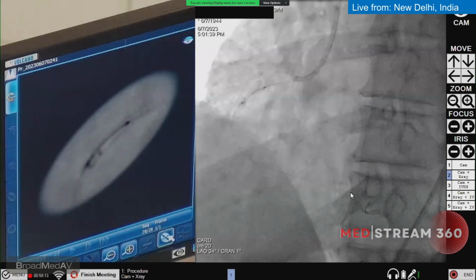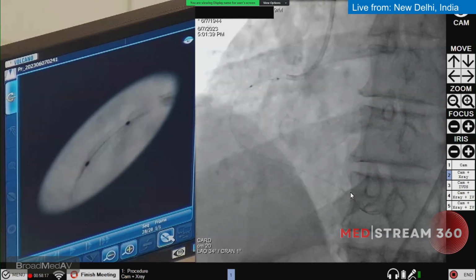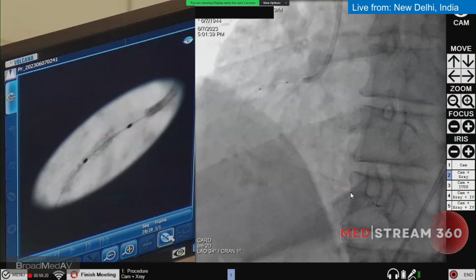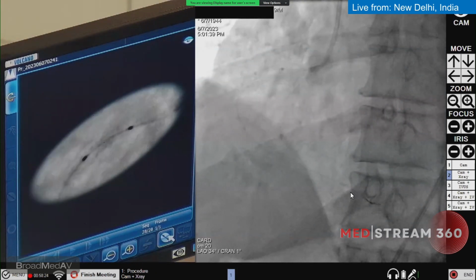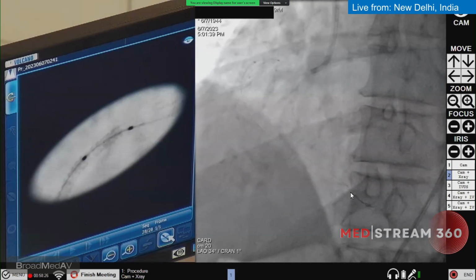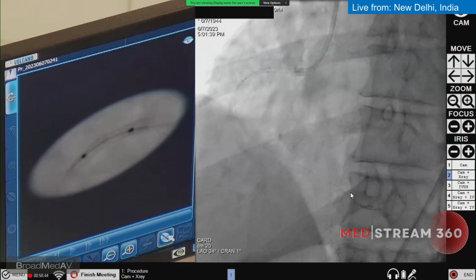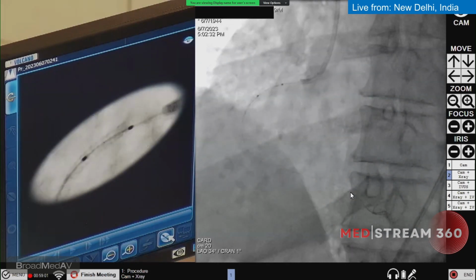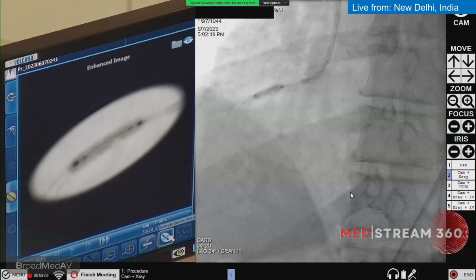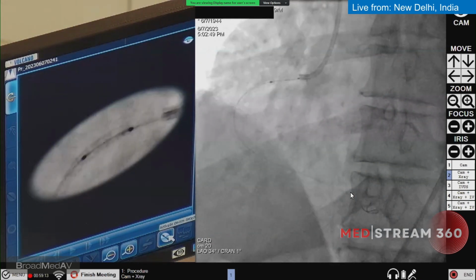Okay, go up. So I've gone up to 16 atmospheres. And how much was the MSA to start with? 4.1. We need to go more. Okay, I'm just trying to do the proximal edge where we have some possibility to go a little bit higher. Okay, go up, deflate. We are just at the edge, right? Okay. Go up to 4, 6, 8, 10, 12, deflate. So I think, on this, we are done.